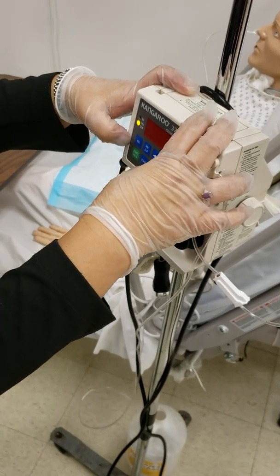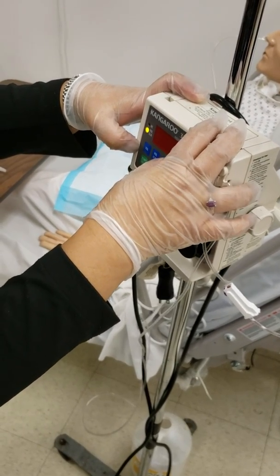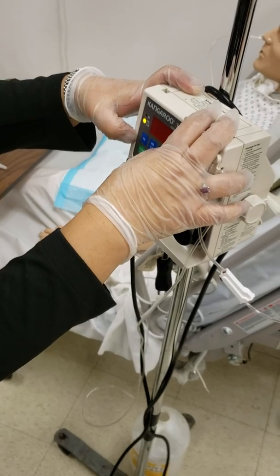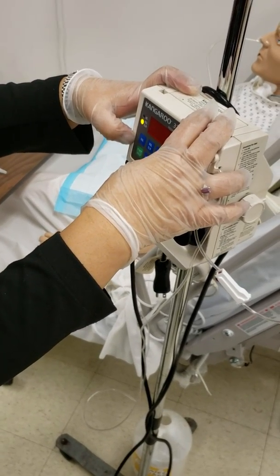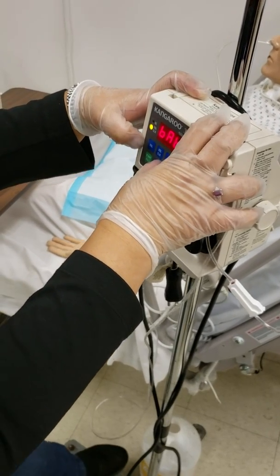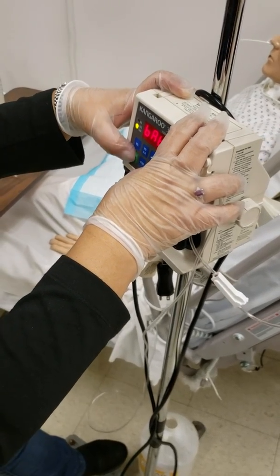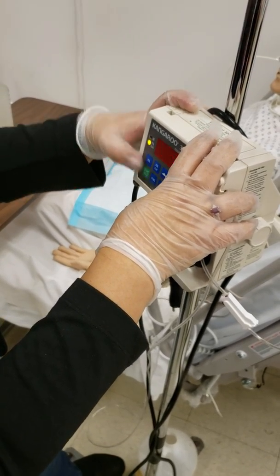And then we will go and why is this not? Yeah, it is 10. But last time it wasn't 10. We have to check. Hold on, let me plug it in for you.